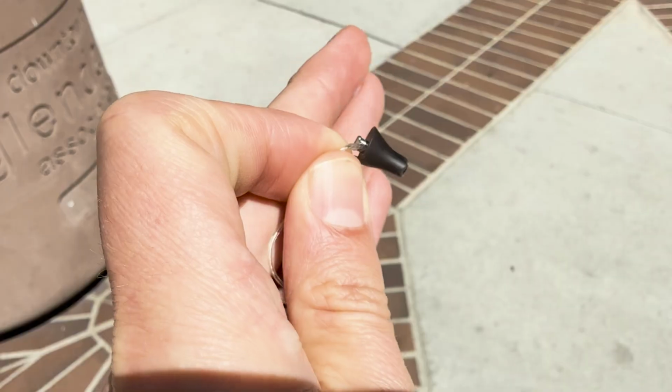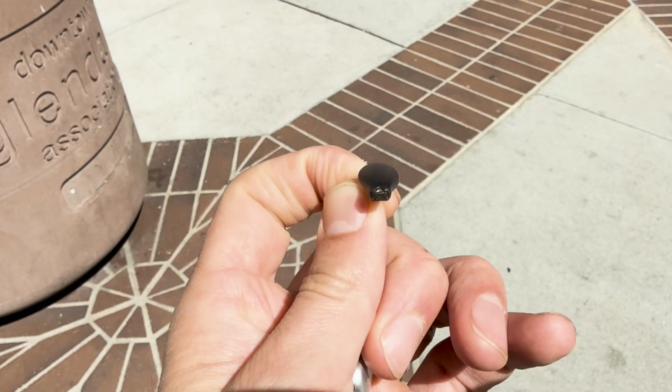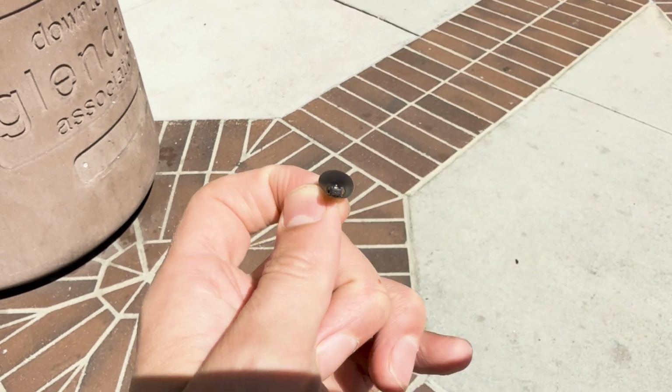The other thing to note is that Signia has the ear tips that I find the most comfortable on the market. In fact, and my audiologist would not recommend this to most folks, I take Signia tips and I put them on other hearing aids when I'm demoing those hearing aids. So if I am using a hearing aid from a different manufacturer, I'll put the ear tips from a Signia device onto that hearing aid. The reason being, I just find these are the most comfortable inside of my ears.